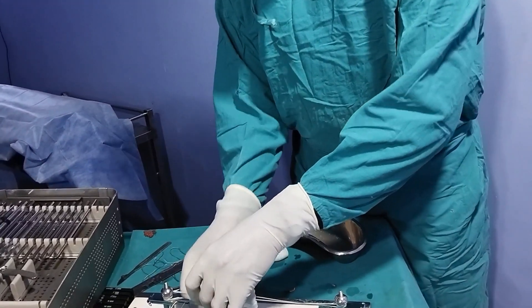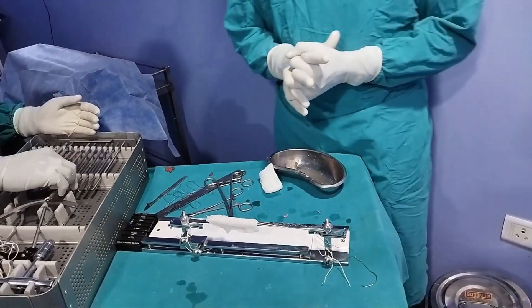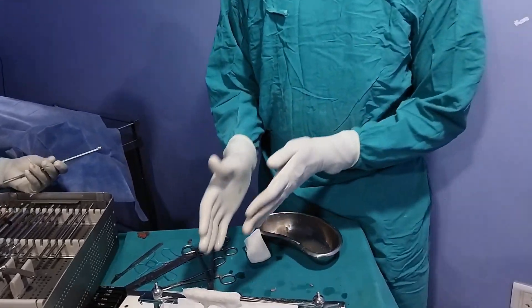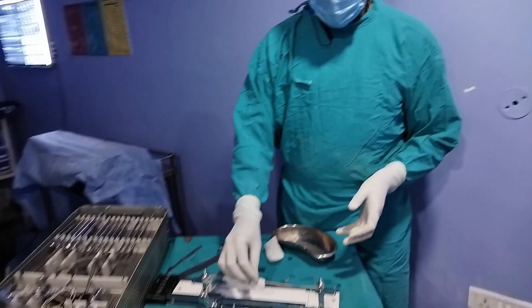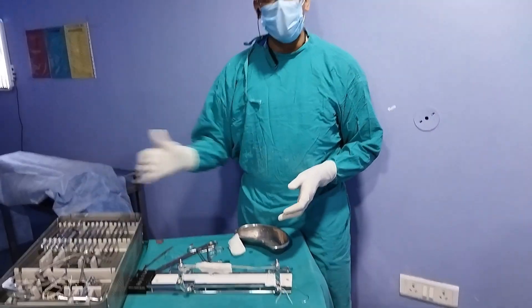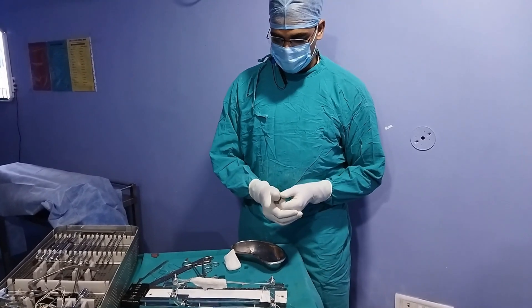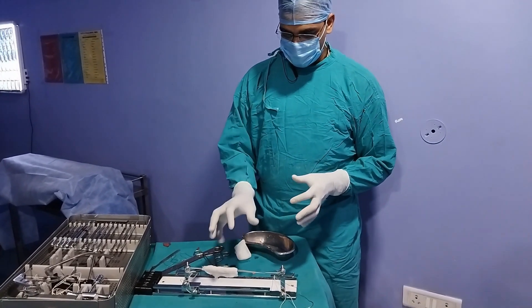The graft is now ready for suspensory fixation. We have a quadrupled, very strong 9 mm peroneus longus tendon, 7 cm in length. On the femoral side it will be fixed with an adjustable endo button, and on the tibial side it will be fixed with a T-button or suture disc. This completes the graft preparation.